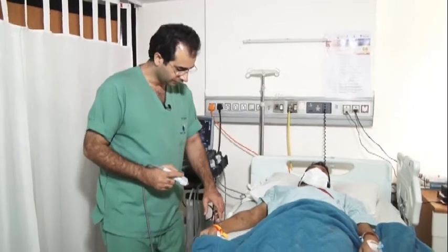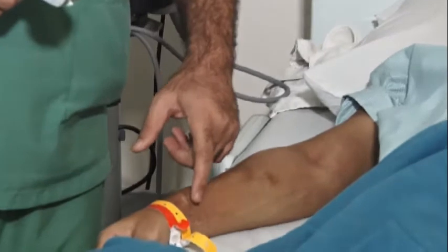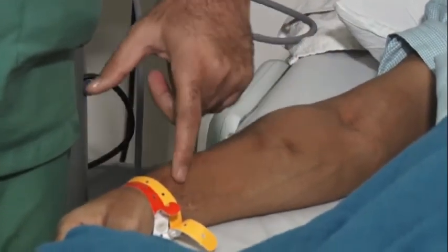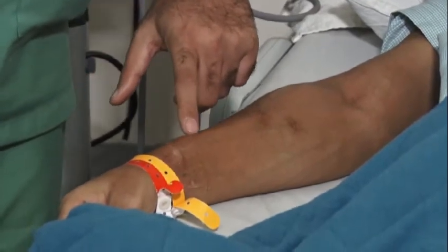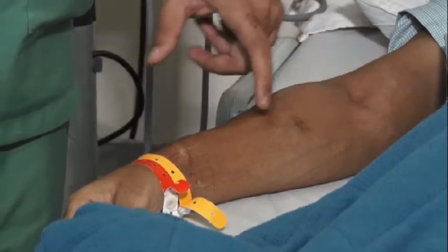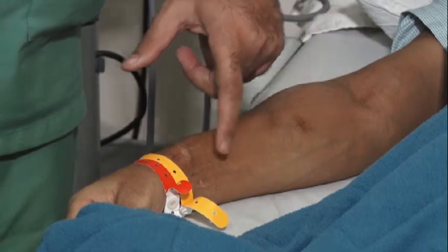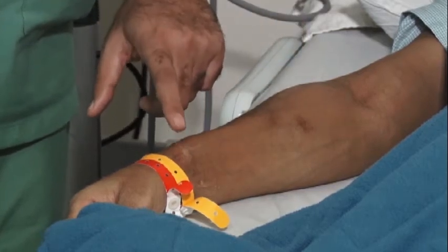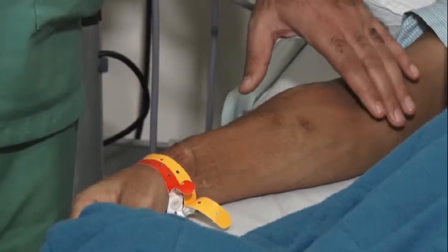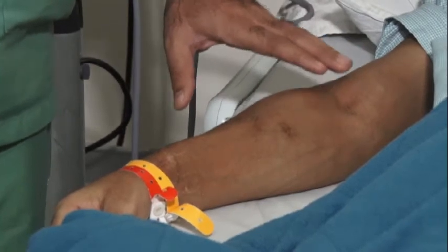So this is the fistula. This is the radiocephalic fistula at the wrist. There will be the feeding artery, the anastomosis and the juxta anastomotic segment, then the body of the AVF and the outflow. We have to see first the proximal part of the radial artery, then the anastomosis, then the juxta anastomotic segment, the body of the AV fistula, and then the outflow. We'll see the main outflow. Is it the basilic vein or is it the cephalic vein? We'll see.